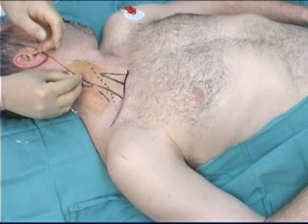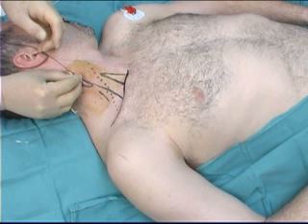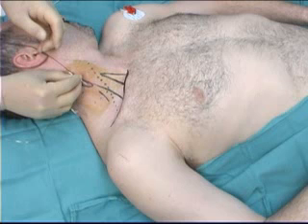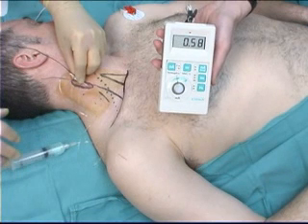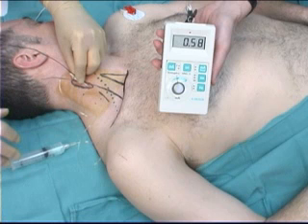The nerve stimulator is then turned down to approximately 0.3 to 0.5 milliamps, and the brisk motor response should still be seen in the biceps or triceps muscles. If this brisk motor response is still present at 0.2 milliamps, it probably indicates intraneural needle placement and the needle should be withdrawn slightly. Brisk muscle twitches should ideally be seen at a nerve stimulator output setting of 0.3 to 0.5 milliamps.